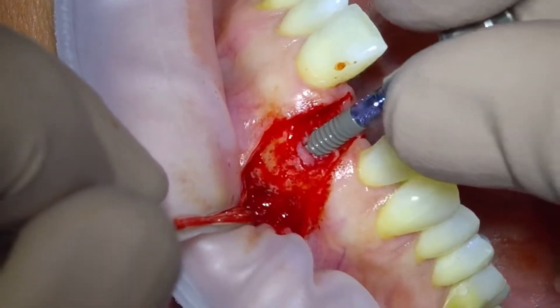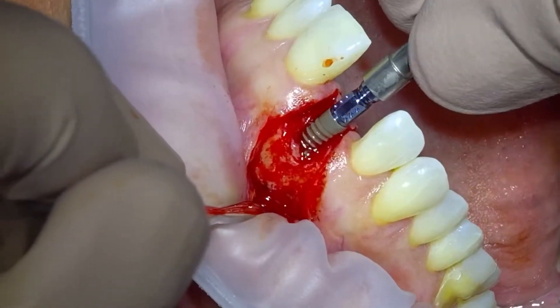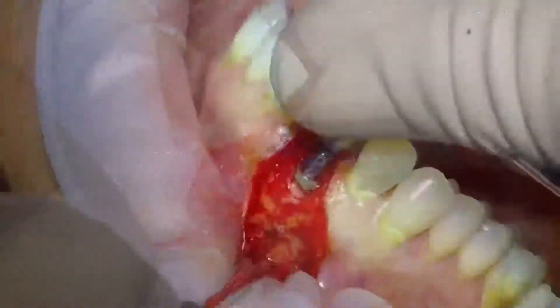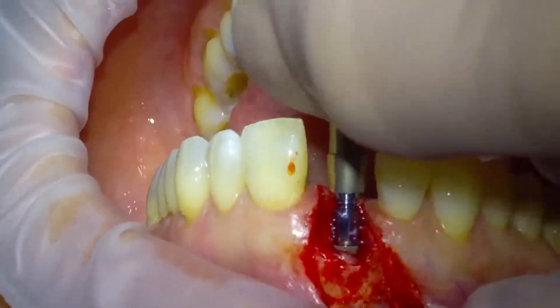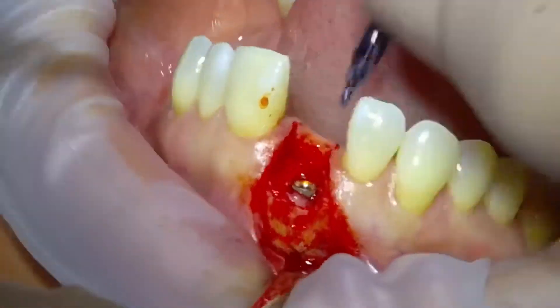This is our 12mm Straumann BLT fixture. I always like to place these by hand so that you get a feel for how tight they're going in and how much primary stability you're going to gain. There's our fixture in place.